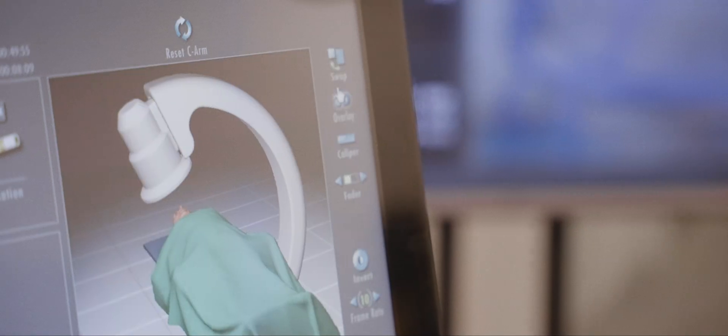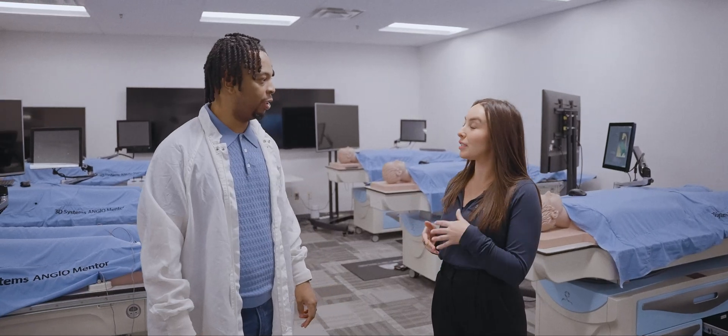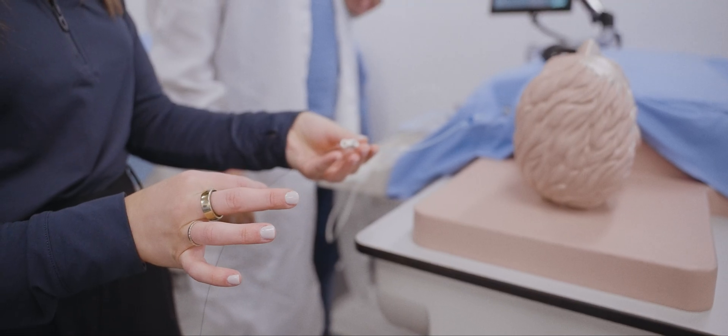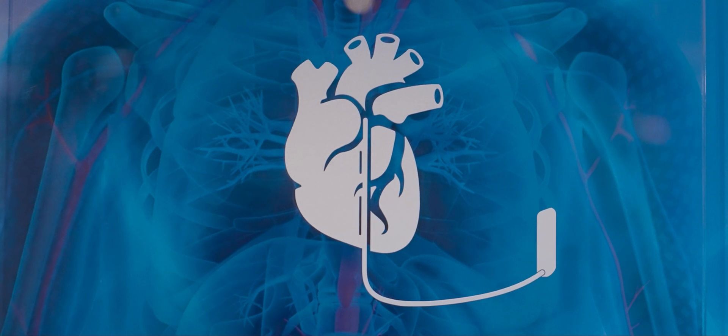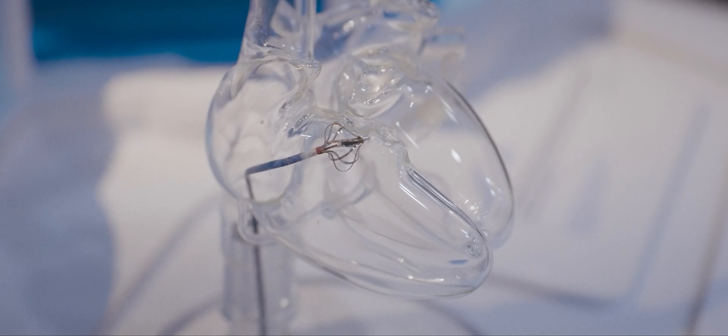They're really good. So this is one of our simulator training rooms that we bring physicians in, we bring physicians in training in. Oh, I'm excited. The first thing we're going to be doing is a pacemaker implant. They have these wires that go into the patient's heart that keep the patient's heart rate from going too low.